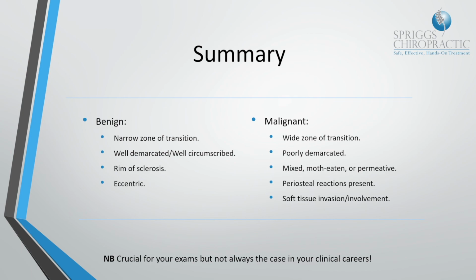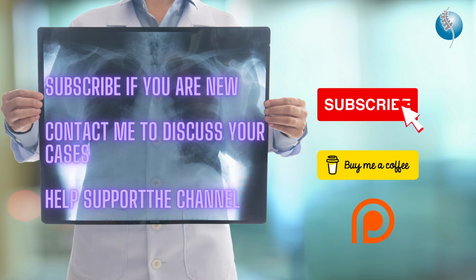So for your clinical careers, always keep in mind that these patients will always need further investigations. So if you do have those patients that come in with a benign or a malignant tumor process, when you're describing it, if it looks benign, send them off for further tests anyway. Because ultimately the MRI scans and your CT scans are going to be much more sensitive than your X-rays of being able to decide whether there is any soft tissue involvement or invasion around it.